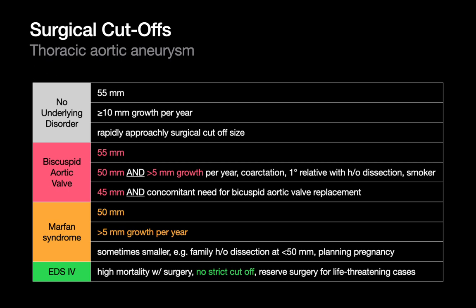It's important to know when measurements reach an important threshold, particularly when a patient may need surgical repair. For patients with no underlying disorders, cardiothoracic surgeons usually like to intervene once a thoracic aortic aneurysm has reached or is rapidly approaching 55 mm diameter, or if growing over 1 cm per year. Thresholds are slightly more aggressive for patients with comorbidities like bicuspid aortic valves, Marfan syndrome, or Ehlers-Danlos.